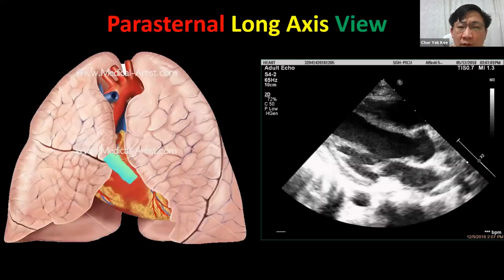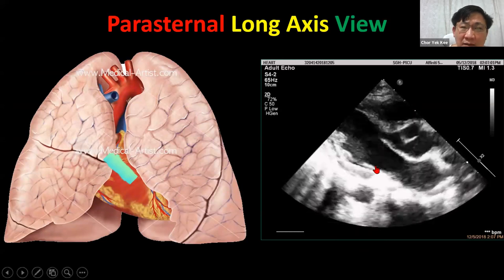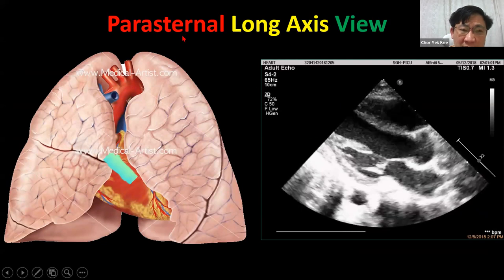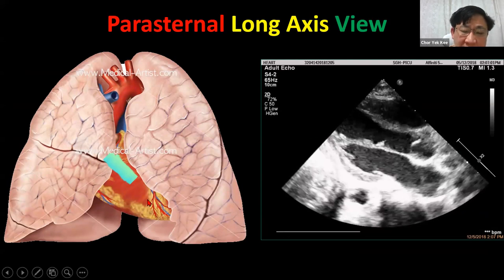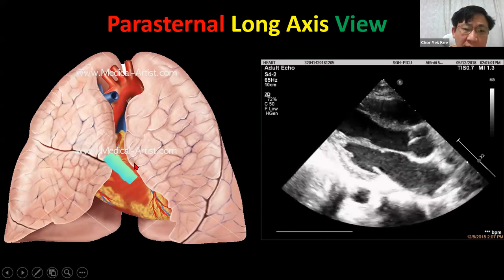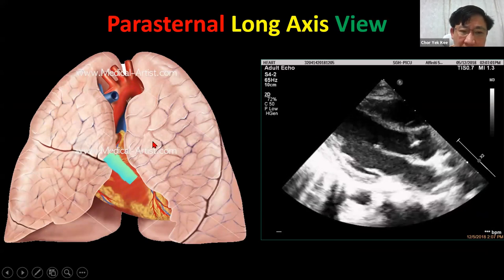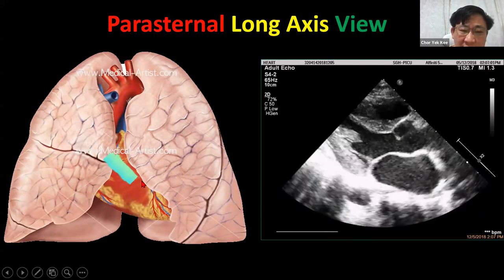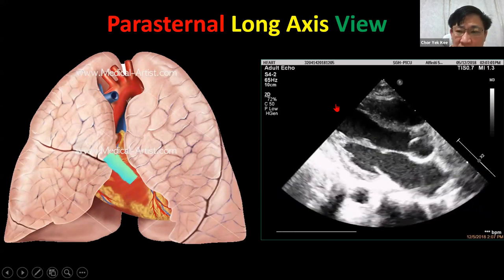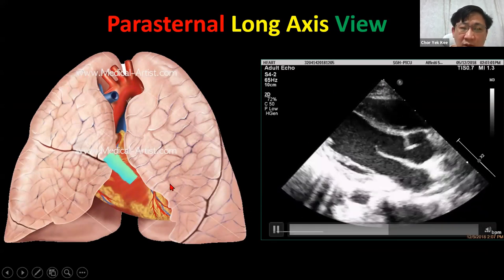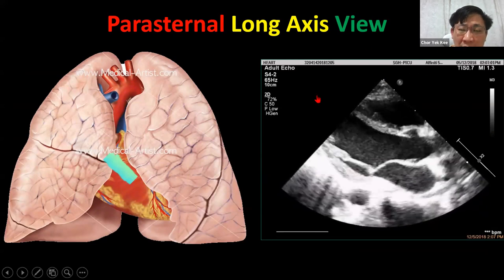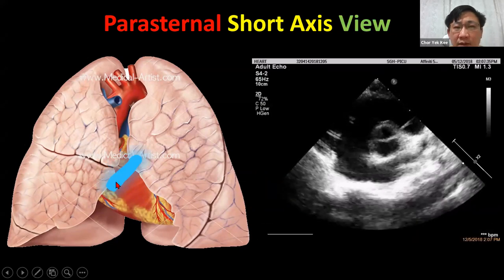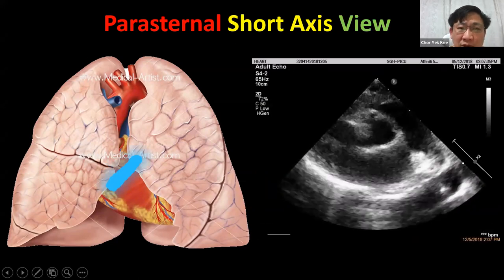Now let's talk about the views. This is what we call the parasternal long axis view. It is parasternal because it's beside the sternum. It is long axis because it follows the axis of the heart. When you turn the probe 90 degrees, you get the parasternal short axis view.